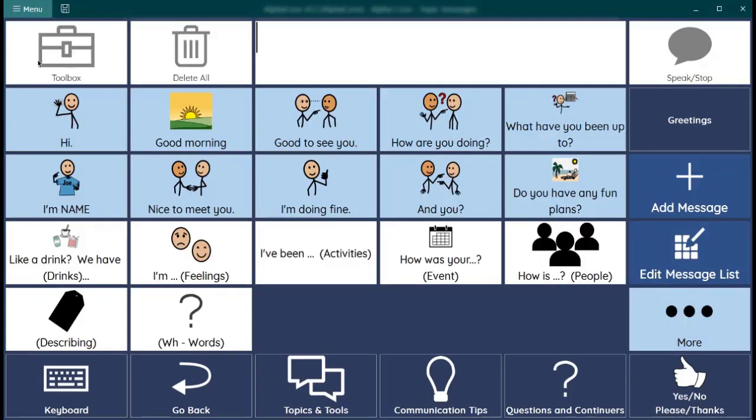To the right of the message box is a speak stop button that will speak your text. Any text you have in the message box and will also stop a message that is being spoken. This can be pretty helpful if you accidentally select a personal message and you're in a crowd.